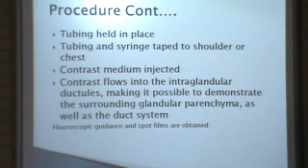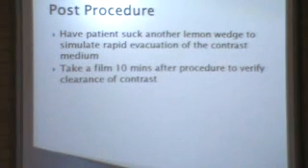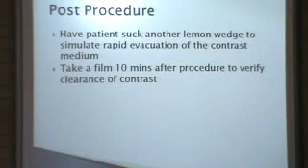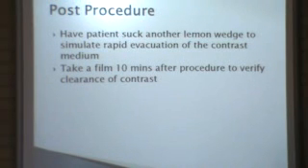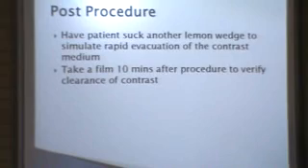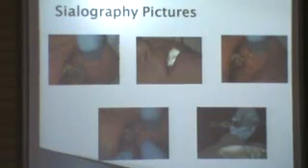After that, you can obtain spot films. After the procedure, the patient sucks on another lemon wedge to stimulate rapid evacuation of the contrast medium. After that, you can take another film 10 minutes after the procedure to verify clearance of contrast.